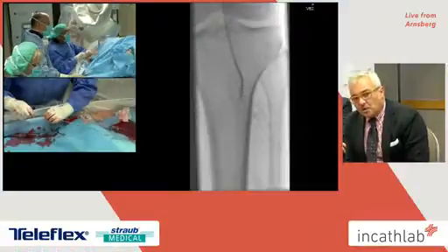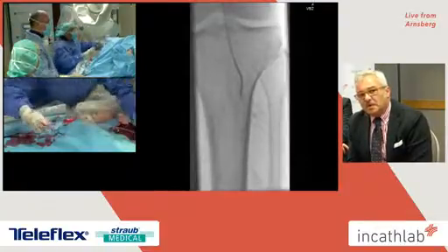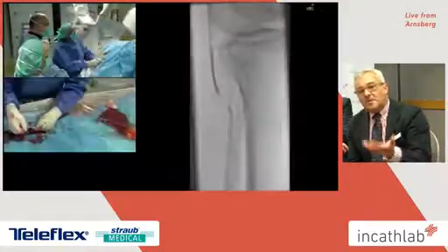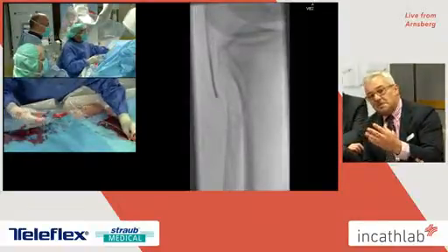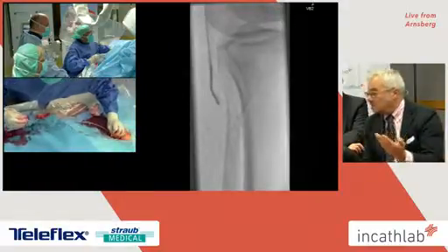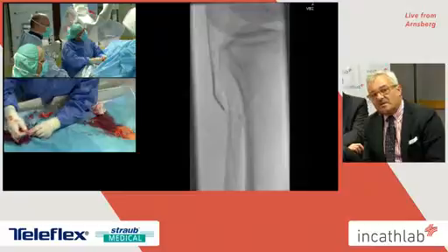Yes, the profile is not so small, but I think for selected patients, for example if you perform a proximal puncture in the proximal part of the anterior tibial, that tract could fit even a 6 French sheath if you want. So it could be possible to use even a retrograde access with this catheter.